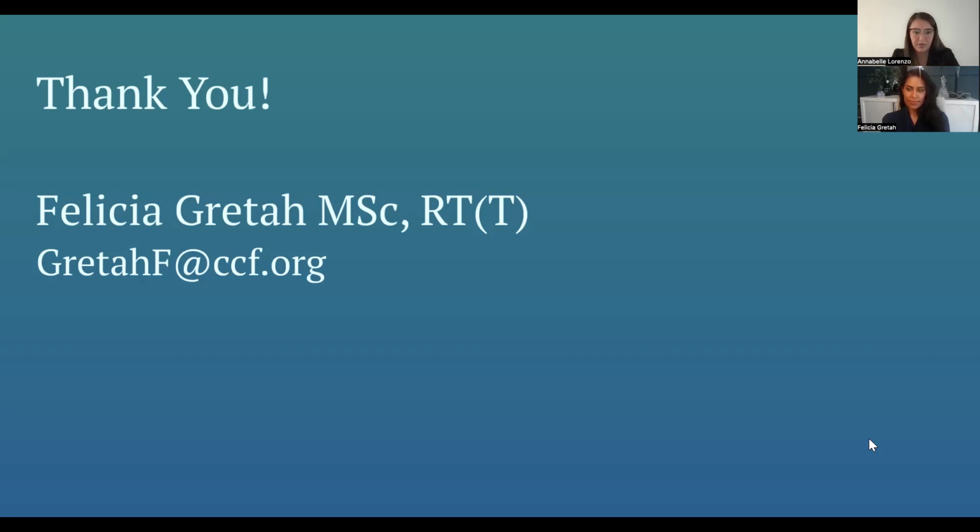By how much do you reduce the breath hold level from the patient's maximum value achieved during SIM? Sorry, can you repeat that? Yes, you know how when you test the patient's breath hold, then you reduce it by 15 to 25% to keep the patient comfortable. What is the average value for you? Is it 15? Is it 25? So we don't reduce the percent of where they are. We choose a test breath that is in the middle, what looks like their average breath. And then we try to make sure that their test breaths are close to where that gap is. But we don't try to reduce it because we're already coaching the patients to take a comfortable breath in, not to take an uncomfortable deep breath.